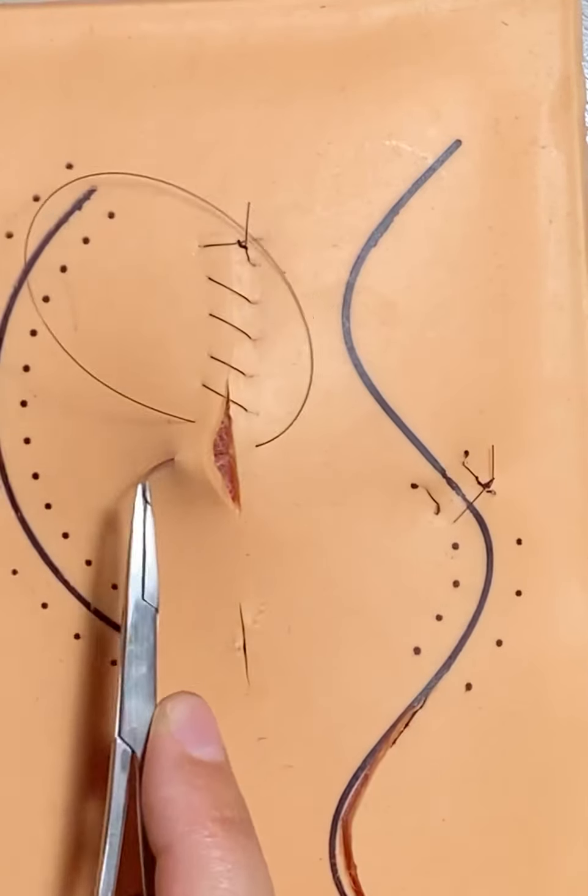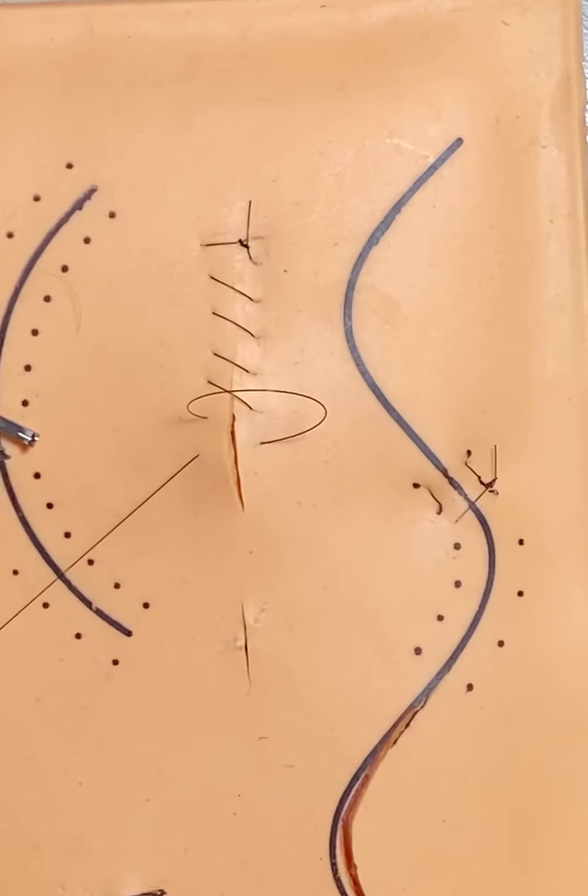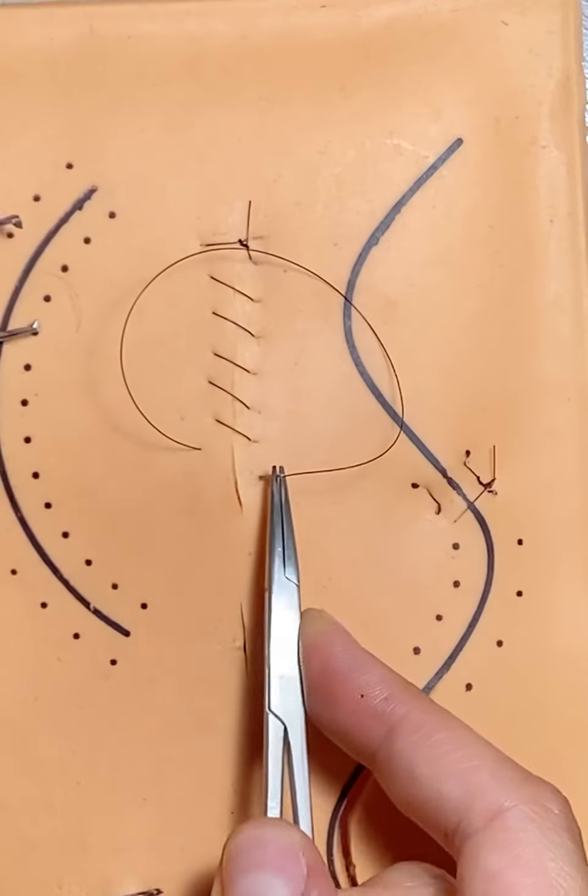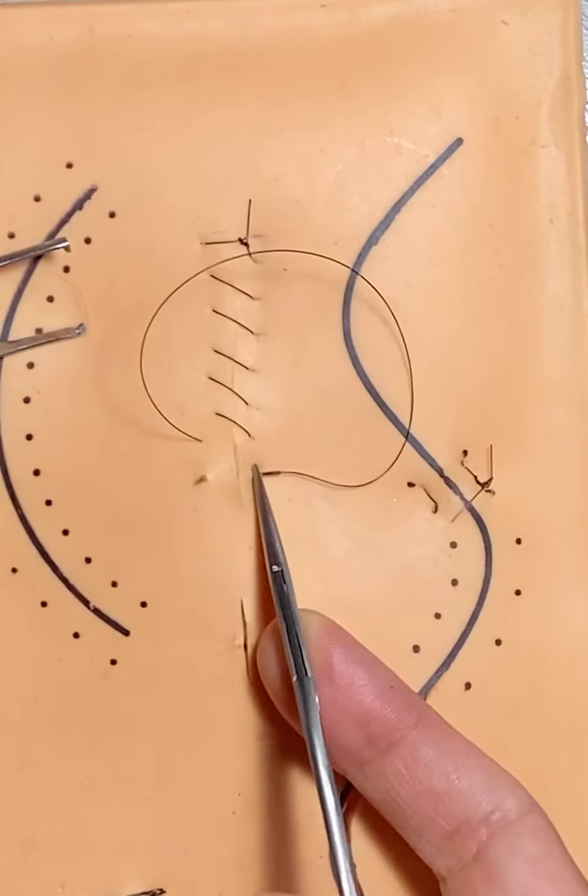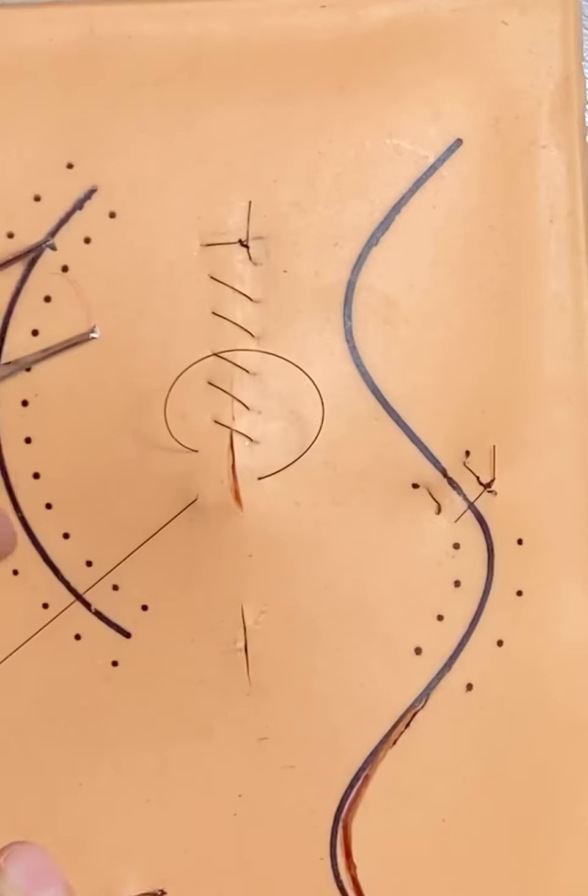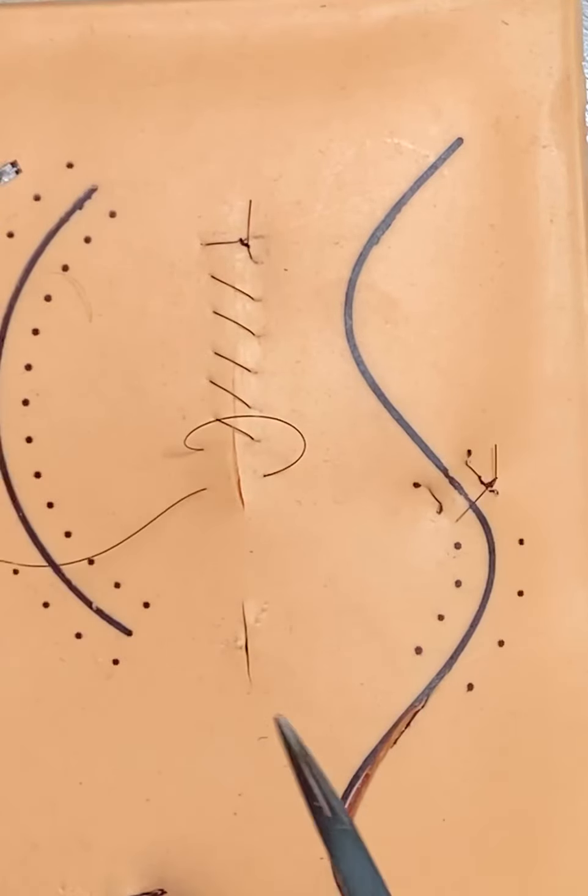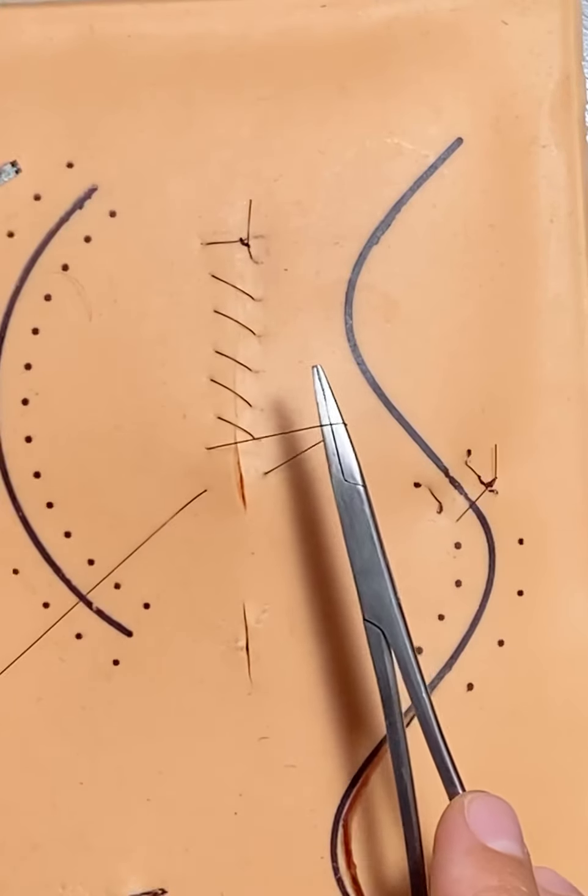We're just going to pretend this is the end of our incision here. Actually, I think I can get away with one more with the suture length. We're going to leave a little loop, same as before. My suture is pretty short, so I have to make sure not to stab myself with that needle, but we're going to use this as our tail to tie to.